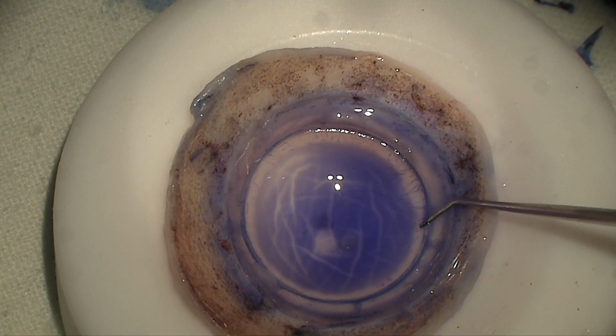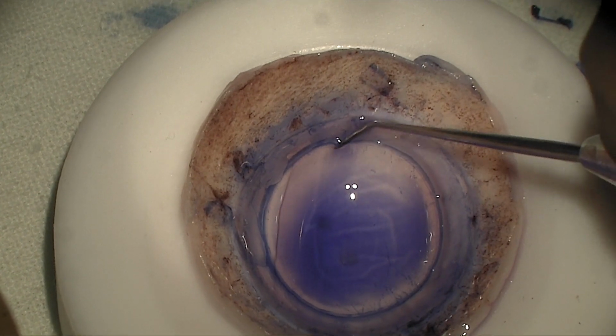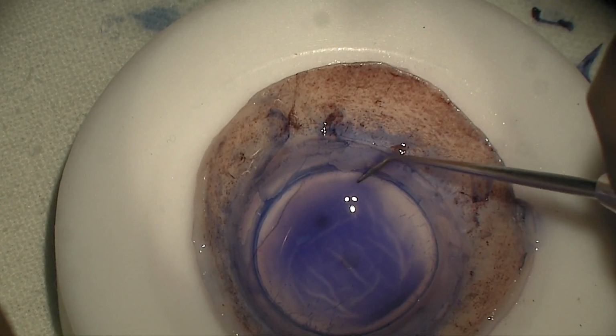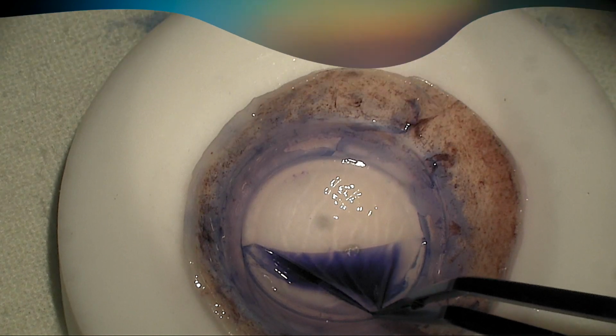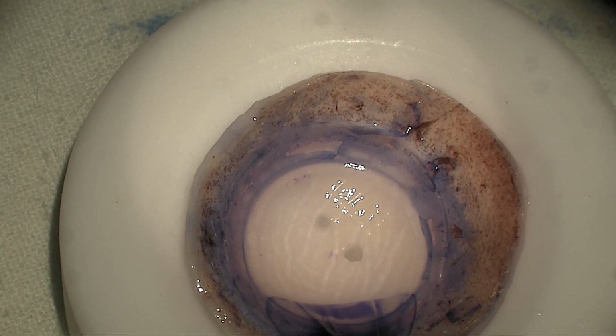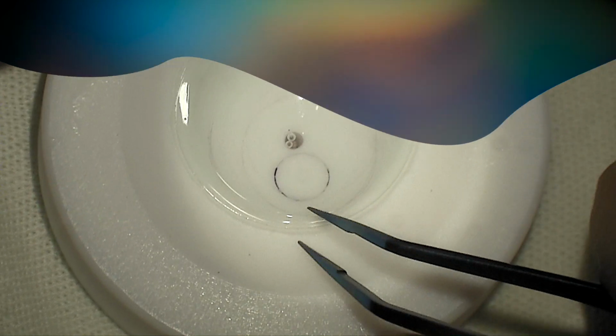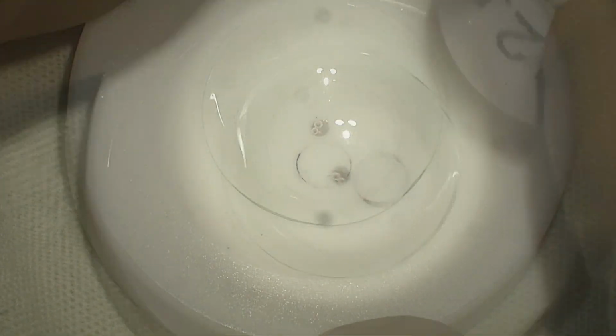Complete 360-degree loosening of the DM with a fine elevator-like instrument. Peeling of the DM endothelium complex up to 90 to 95%, which is more than what is done conventionally. Sizing of the BCL to 12 mm for better air trapping.